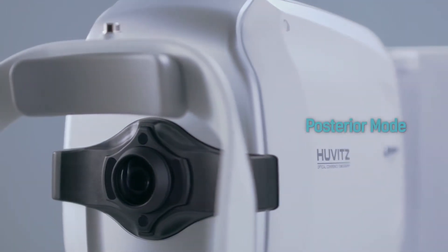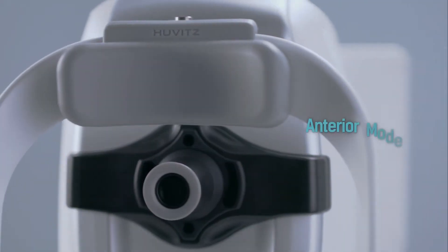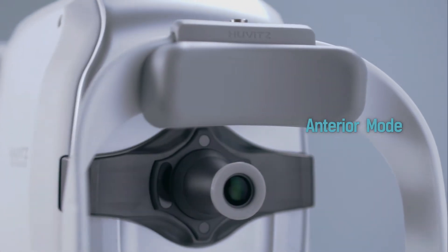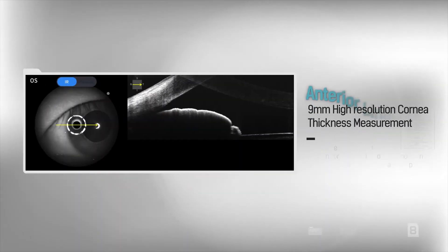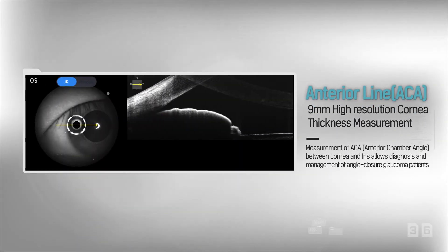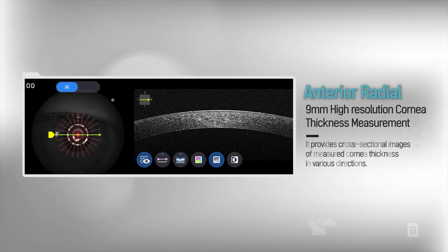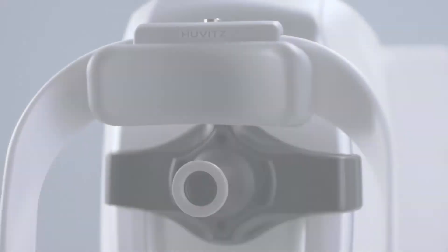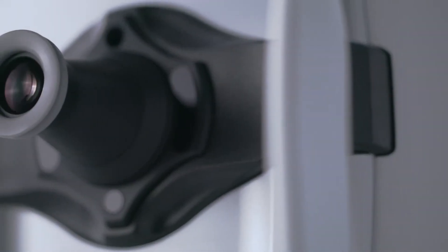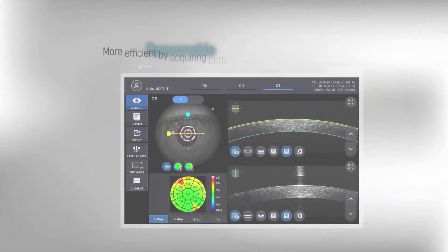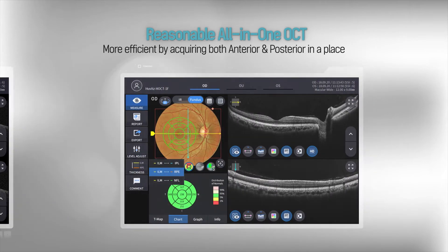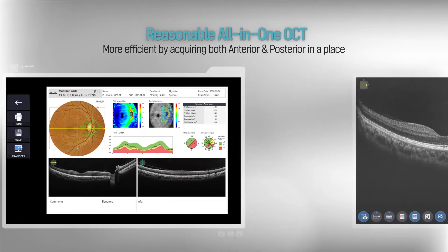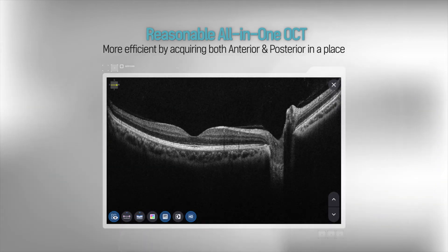By the anterior segment module, it is able to measure and analyze cornea thickness, angle, and 3D image. H-OCT provides a 9mm wide chamber view and high resolution cornea thickness scan. It is an efficient all-in-one OCT, which can measure anterior and posterior segments in one space.